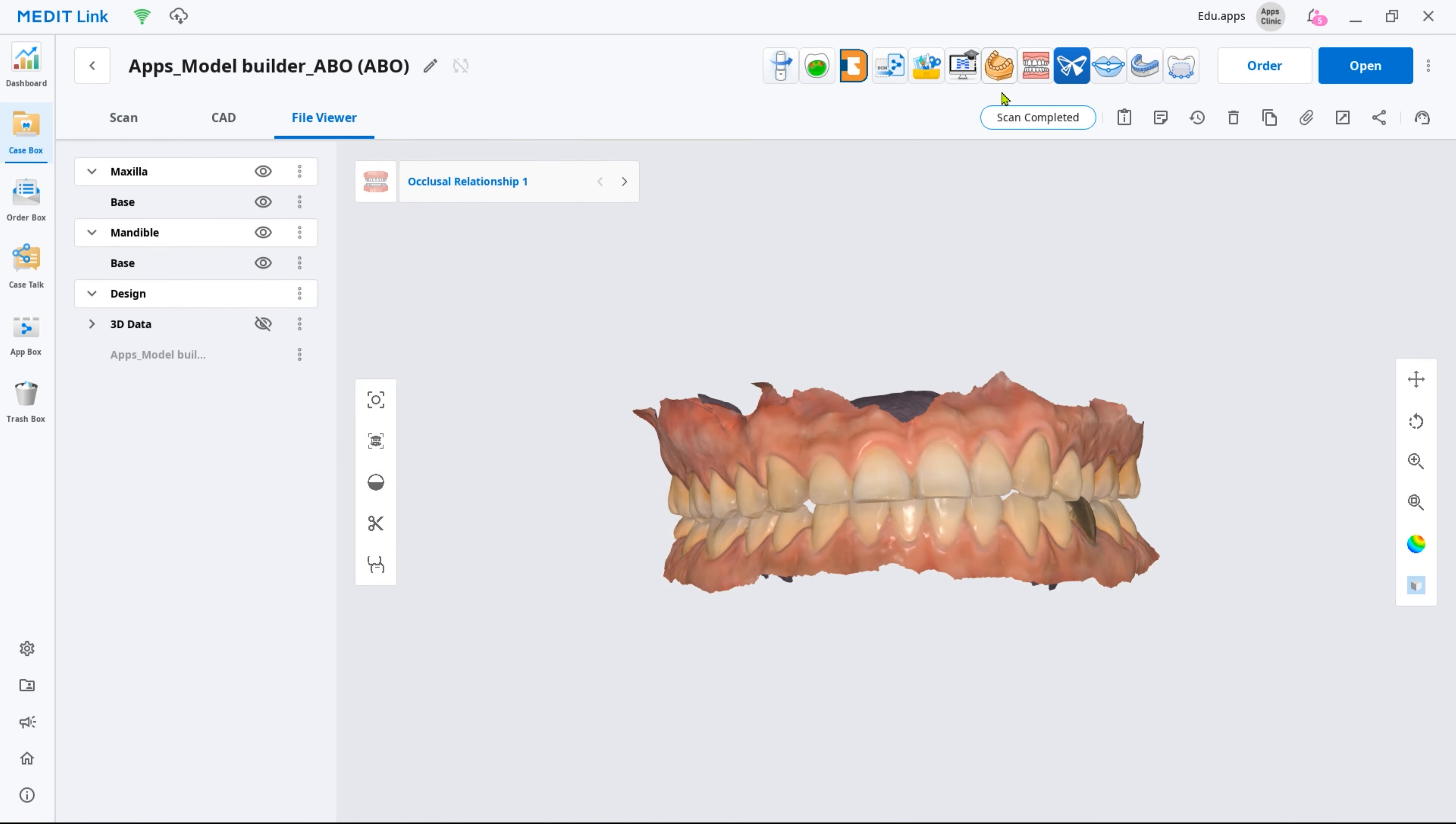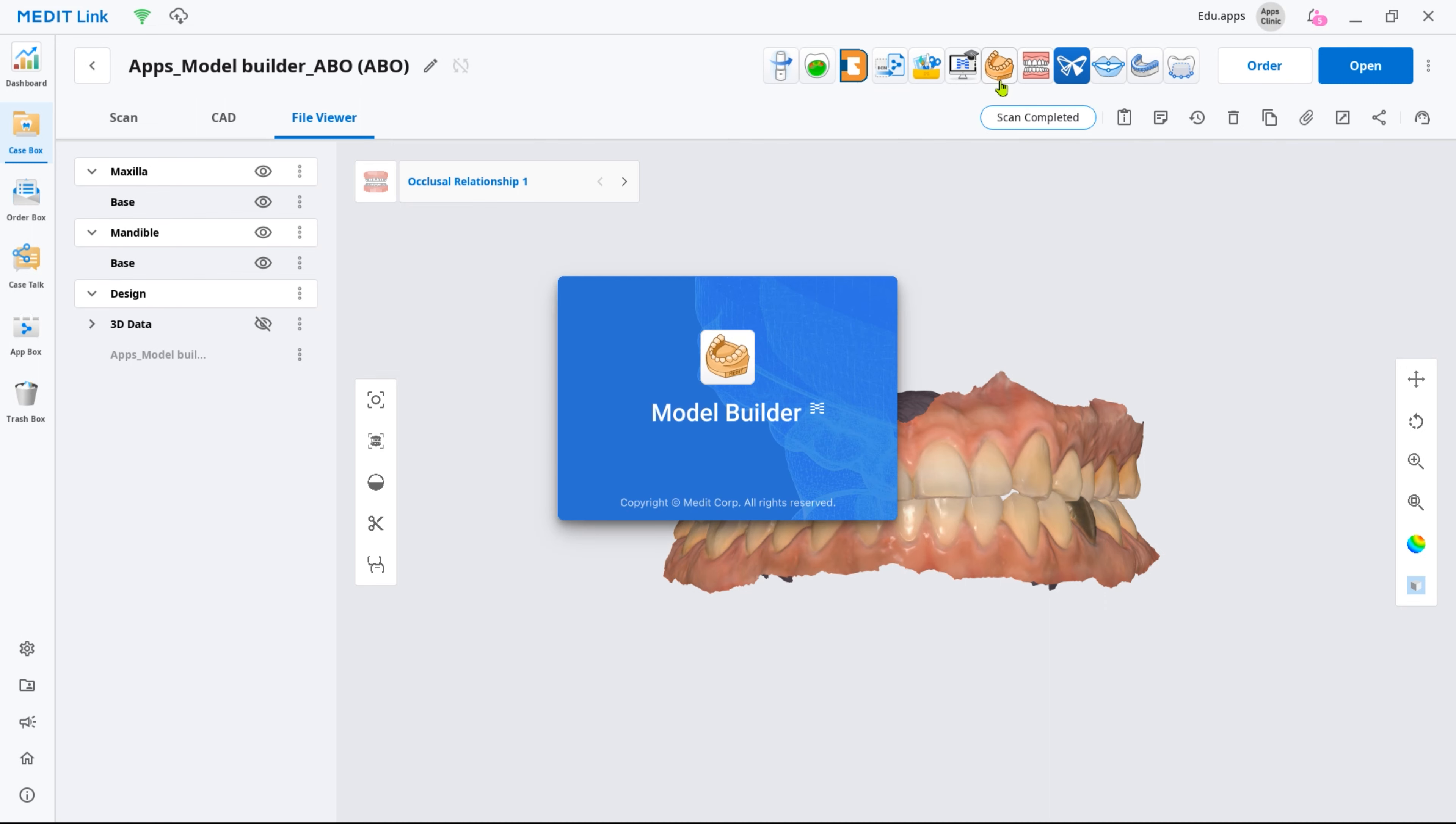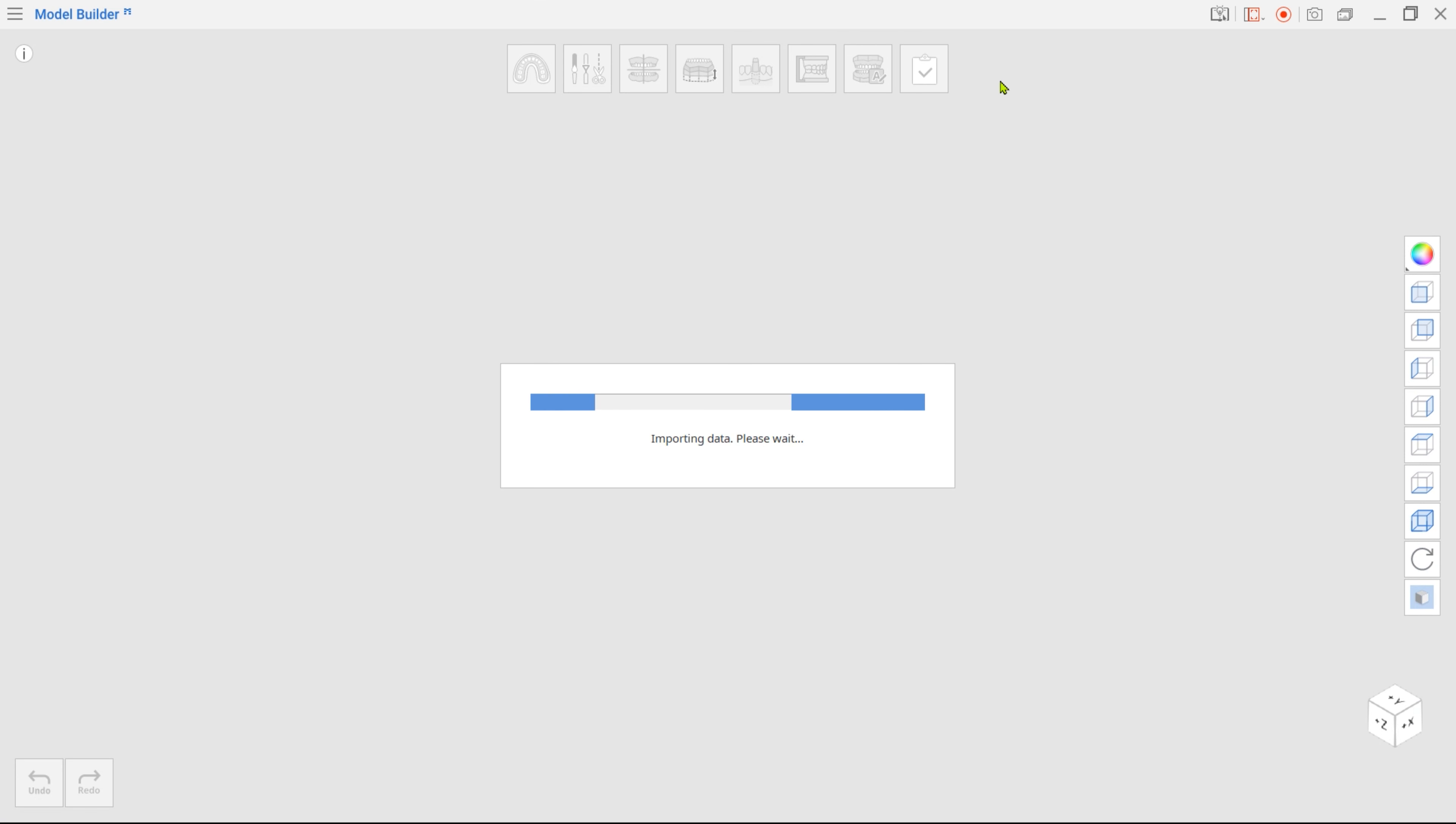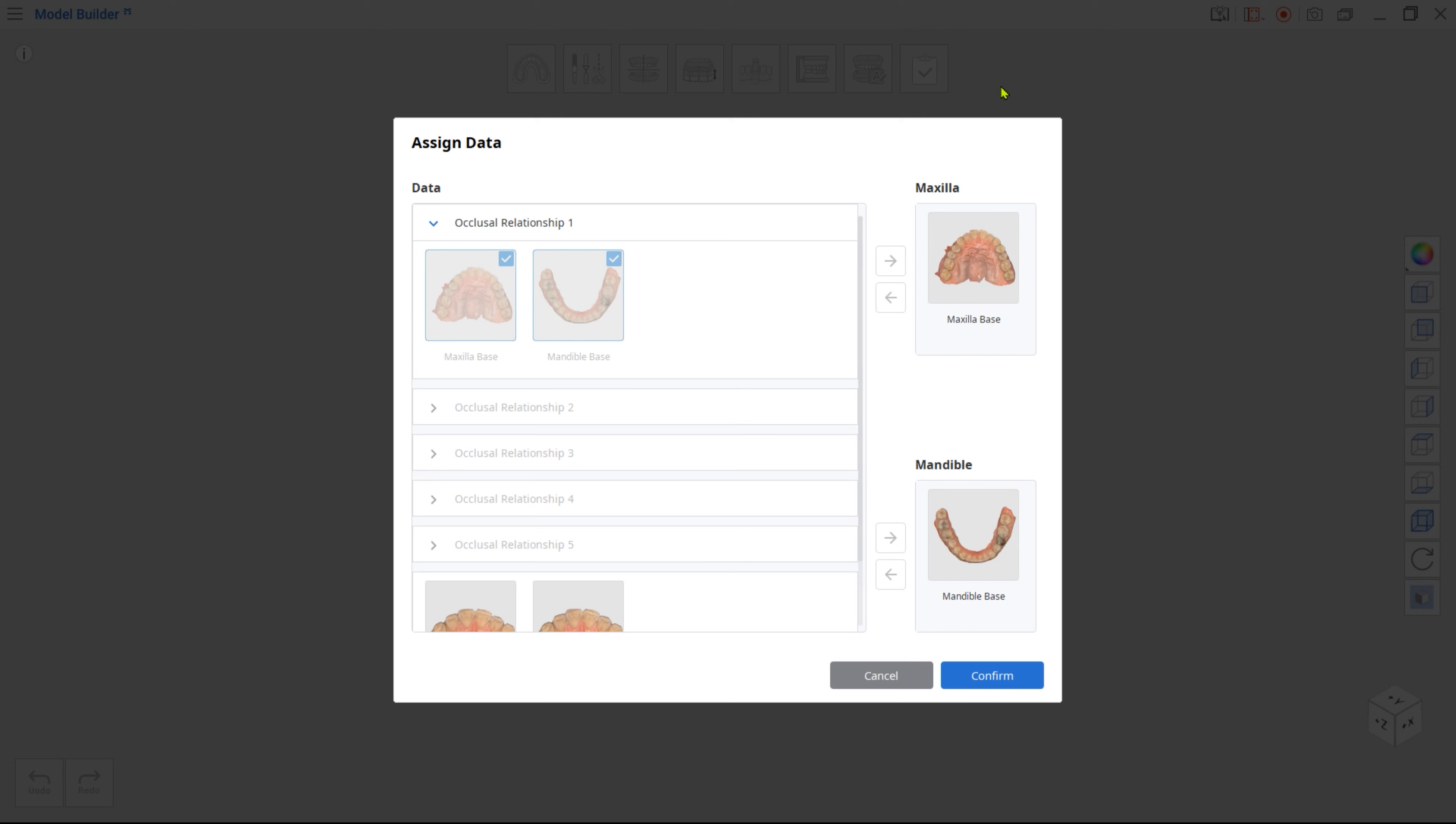After scanning, open Model Builder by clicking the app icon at the top. Your scan data will be automatically assigned.